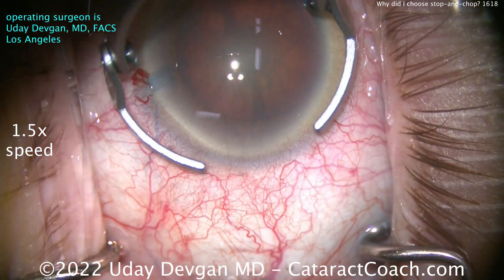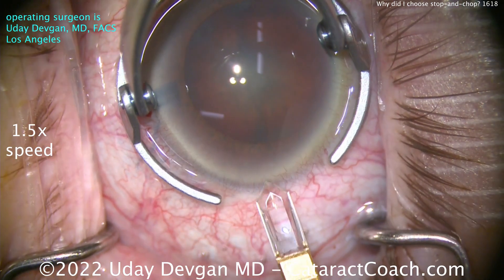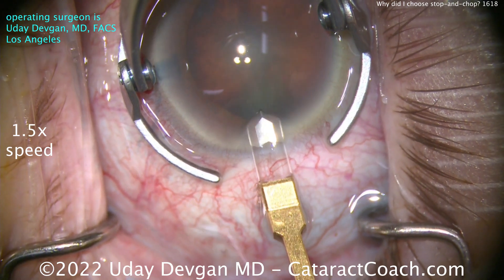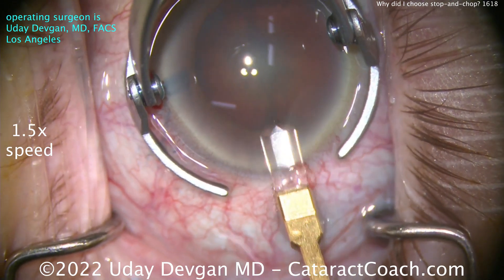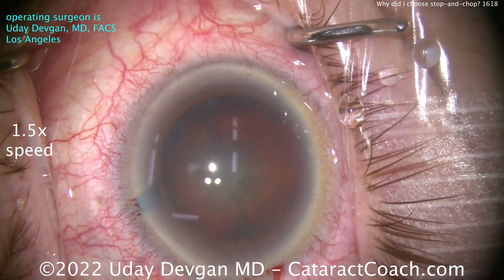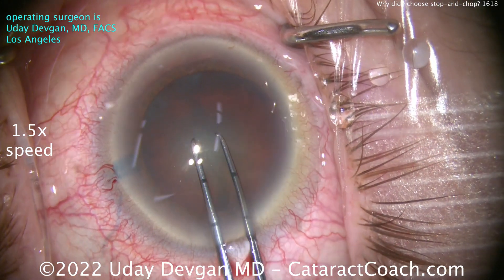This patient has a shallow anterior chamber, about 1.7 millimeters. Let's start off by making that main incision using a little tiny 1.8 millimeter diamond. We're going to slightly enlarge the incision to about 2.2 millimeters, and of course we're barely nicking those limbal vessels to have good long-term sealing.